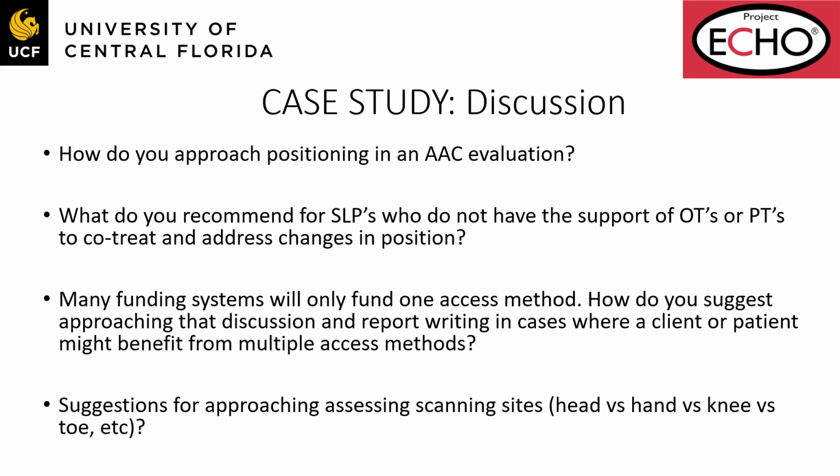Many of your reps are going to have a lot of experience with some of these different concerns and some of the accommodations or modifications to the systems that they have seen and that they know are successful or compatible with the equipment. And so even if it involves extending some of the time on some of my assessments in order to accommodate multiple reps, that's been very effective.